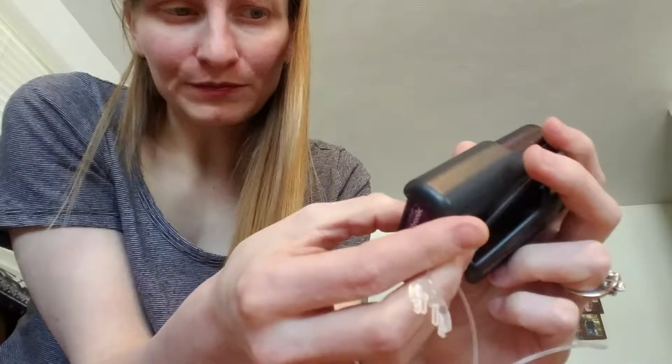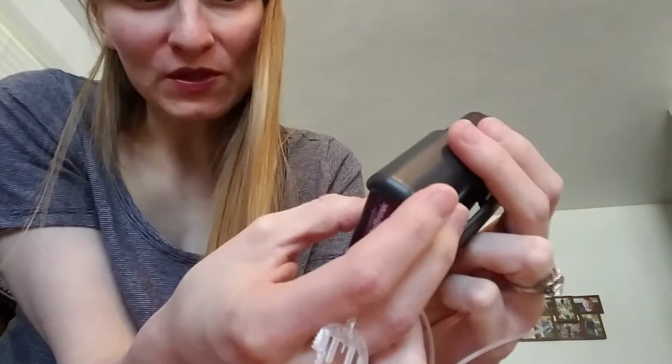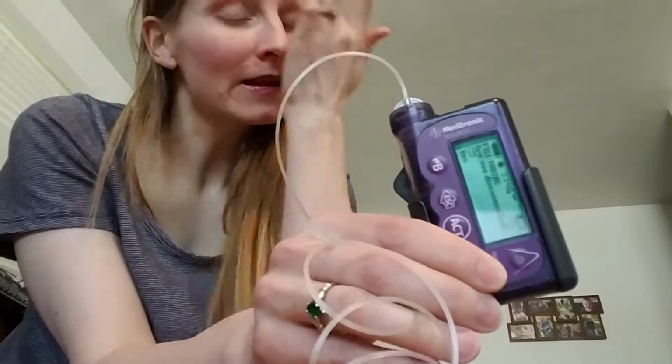Okay, so now, rewind complete. Place and lock reservoir on pump, so we did that, and then press act. Okay, fill tubing. Are you disconnected? It would be bad if I wasn't disconnected and I did this, because then you wouldn't, for one, be able to see when you're done priming it, getting all the insulin filling the tubing. And that also means then I'd be giving myself insulin that I don't need, which would also be a problem.